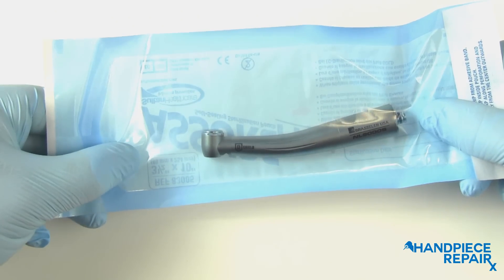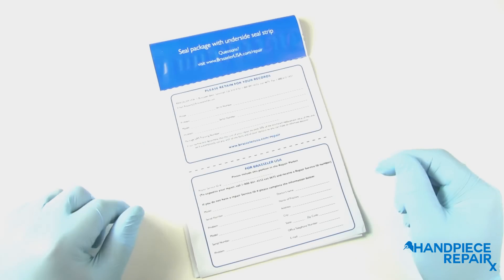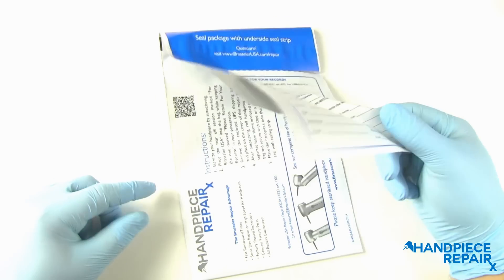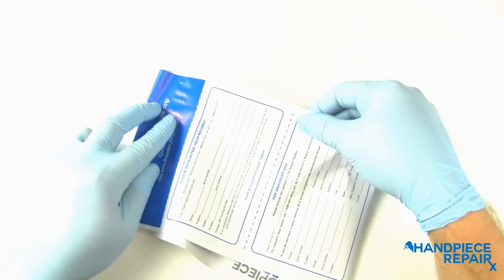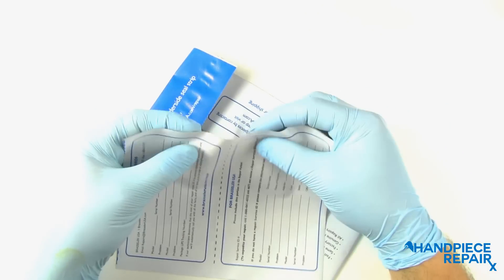Please keep the hand piece in the autoclave pouch for shipping. The repair packet has an outer flap with tear perforations. Separate these sections and fill out your information in the space provided.